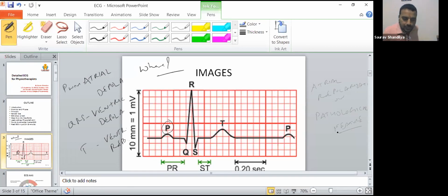Then any other things, which is the common overview I want to give you. Say, for example, atria repolarizes, approximately, if you talk about the duration, about 0.15 to almost 0.2 second, immediately after the P wave. That happens anyway. However, this occurs just at the moment of the QRS complex. So how is it recorded in ECG? It is totally obscured by, as I told you, the QRS wave. The atrial T wave is rarely observed in ECG, but it is observed in some conditions.